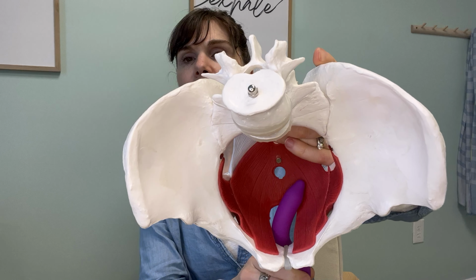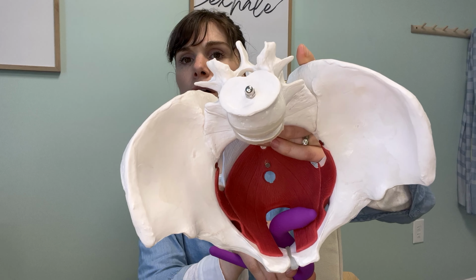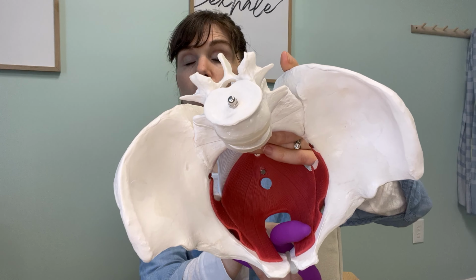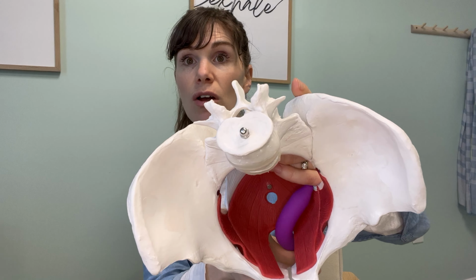Okay, and as you are pressing around, you are looking for spots that are uncomfortable or might feel tight, especially if they reproduce the pain that you feel.